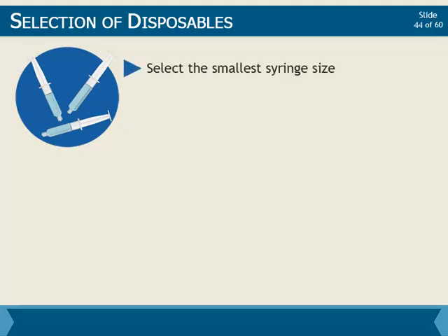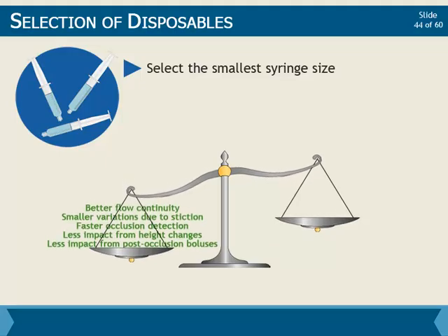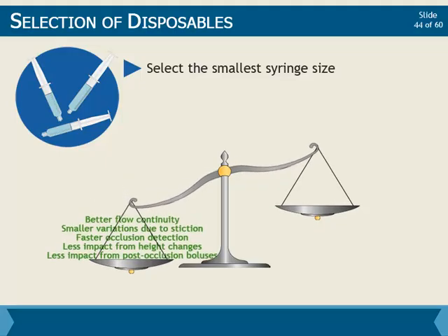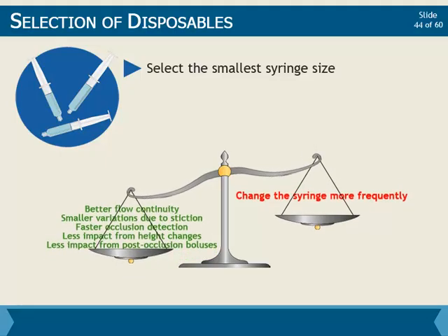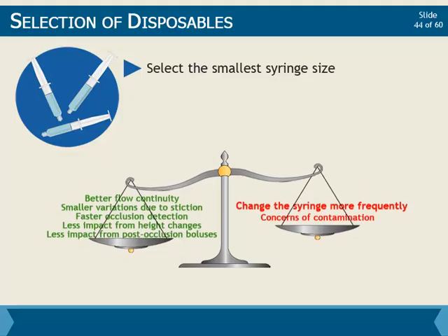However, selecting the smallest syringe size is not always an easy task. Smaller syringes do have all the previously listed benefits, but due to their smaller volume, it also means that you may have to change the syringe more frequently. A frequent changeover also means enhanced concerns of contamination.